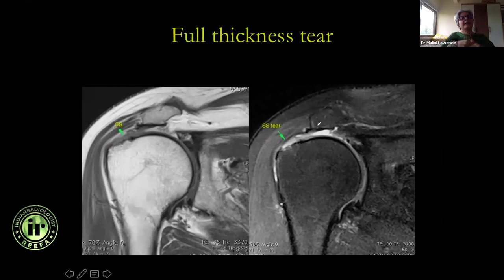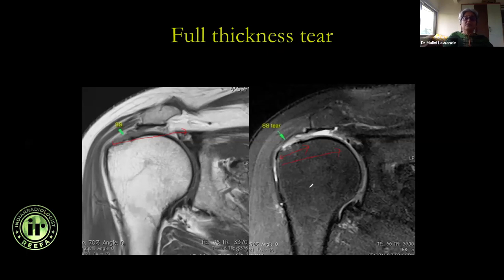A full thickness complete tear — the entire AP extent is torn, the entire tendon is torn. What is important is how much the tendon is retracted. This tendon is retracted up to the glenohumeral joint by approximately 4 centimeters. In another case it may be retracted 1.5 centimeters up to mid humeral head, or 3 centimeters up to medial humeral head. This is very important because the surgeon can decide whether arthroscopic surgery can pull the tendon back, or whether it's too retracted — poor prognosis, may require open surgery or tendon transfer.